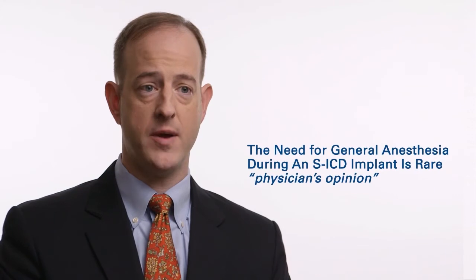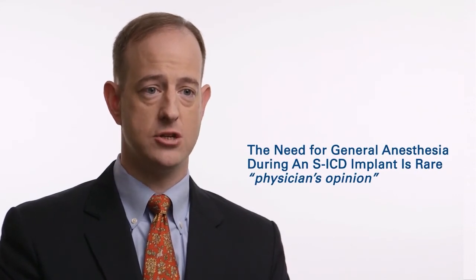And I think that the need for general anesthesia is the rare patient. I think that if there is the opportunity to have anesthesia services via MAC anesthesia, propofol, that is sufficient for the vast majority of patients, and it is the rare patient that requires general anesthesia.